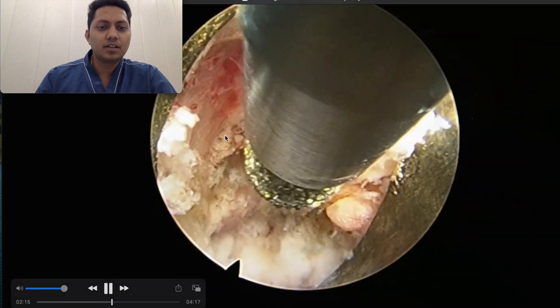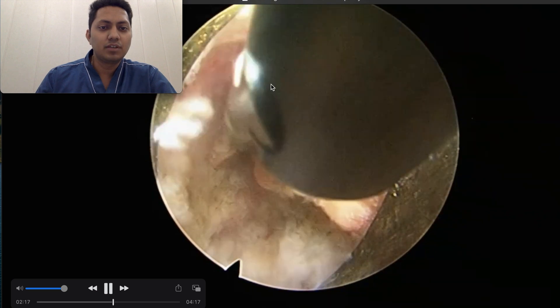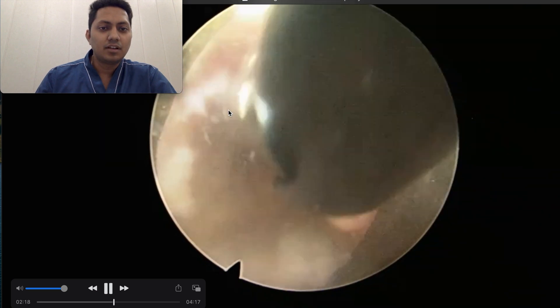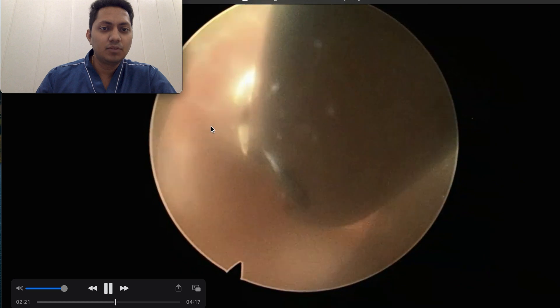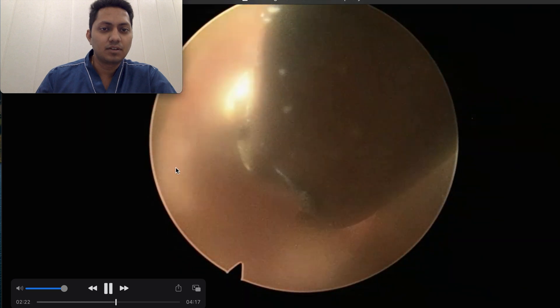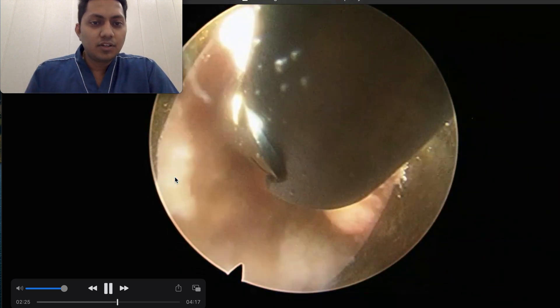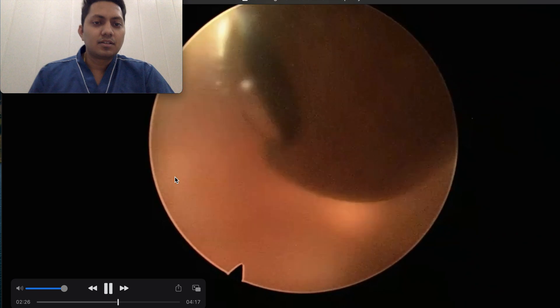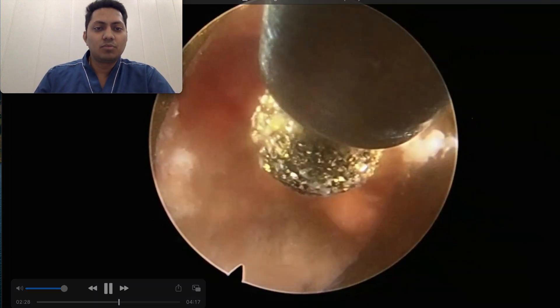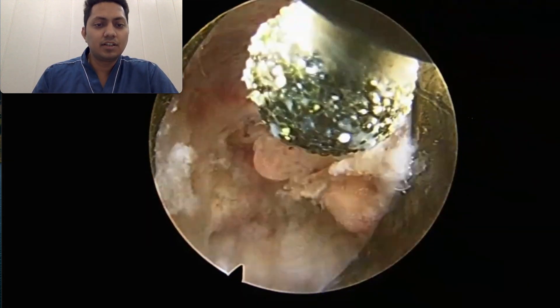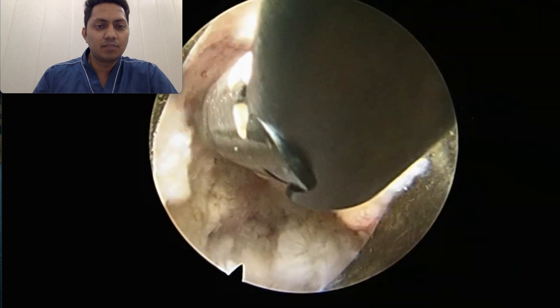You can see that there is only a thin plate of bone left here and we will be gradually removing that. Whenever you are operating in this lower part of the foramen, you must remember that it is a highly vascular area and you will encounter a lot of oozing and bleeding.